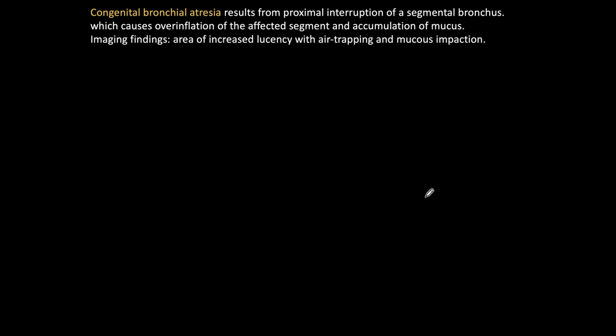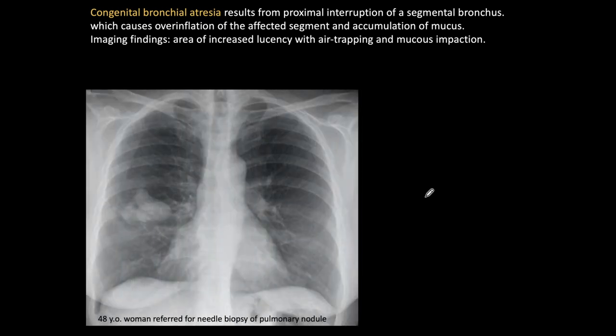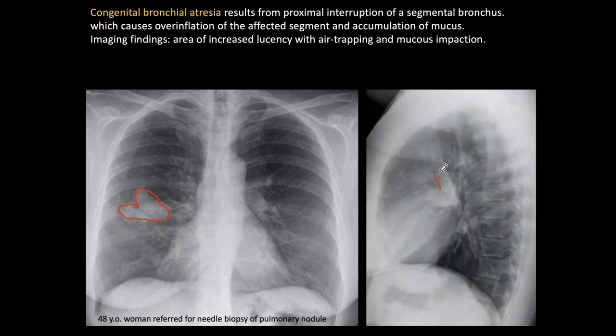The third condition I want to talk about is congenital bronchial atresia, which is a focal lesion of the lung occurring in a segmental bronchus that is absent. There is a proximal interruption and the bronchus is not present. This causes overinflation of the affected segment and accumulation of mucus. The imaging findings are an area of increased lucency with air trapping and mucus impaction. This is one case — a patient referred for needle biopsy of a pulmonary nodule. At first glance we can see this is not a nodule; the appearance is very typical of mucus impaction.